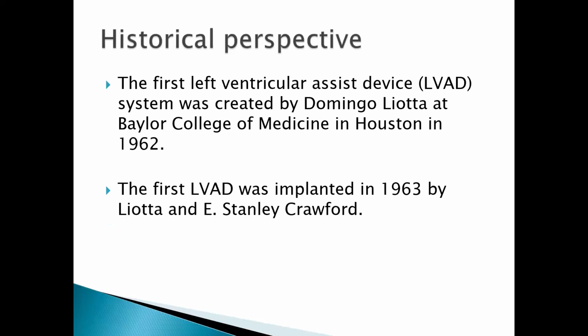Next slide, please. So how did the ventricular assist device come into perspective in cardiology? Historically, it was noted that the very first left ventricular assist device system was created by Domingo Liotta at the Baylor College of Medicine in Houston, in 1962 rather. However, it was not until 1963 that they first implanted this ventricular assist device. But that very first implant in 1963 did not really work very well, so it failed.